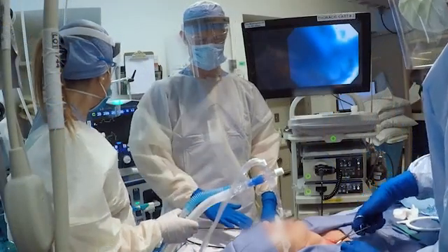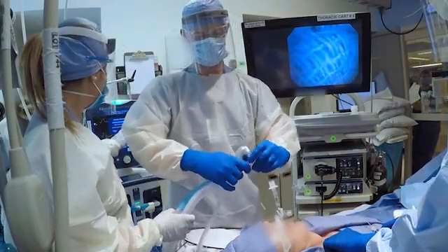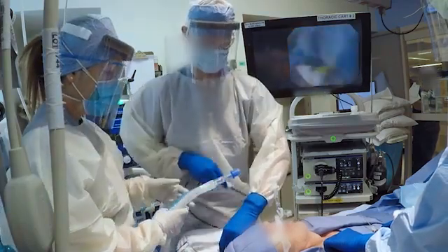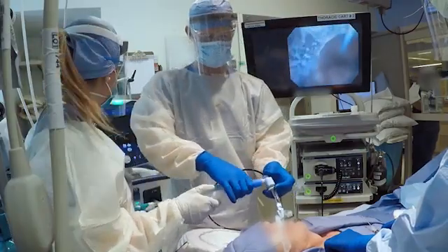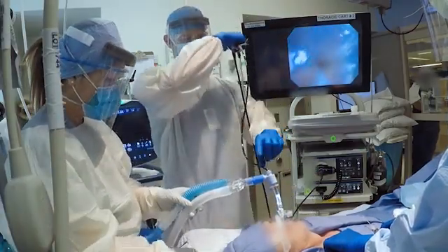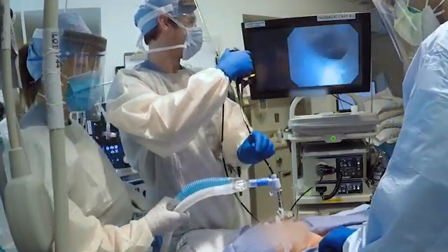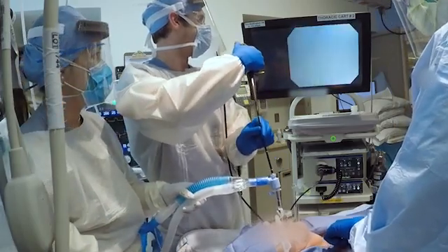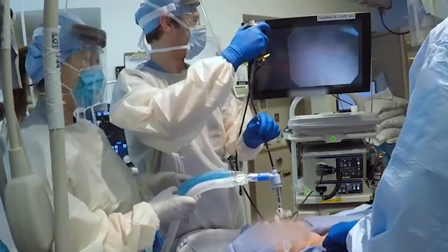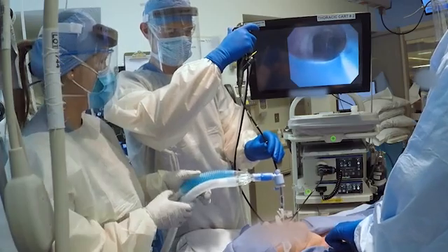Ask the respiratory therapist to induce apnea by placing the ventilator on standby. Then disconnect the oral endotracheal tube from the ventilator circuit and attach a bronchoscope adapter to the oral endotracheal tube. Insert the bronchoscope into the adapter, reconnect the circuit, and resume ventilation. Advance the bronchoscope into the airway and briefly survey the trachea to clear any obstructing secretions. Once all team members are ready, advance the bronchoscope into the oral endotracheal tube until the camera is aligned with the end of the tube. At that point, the respiratory therapist should again induce apnea.